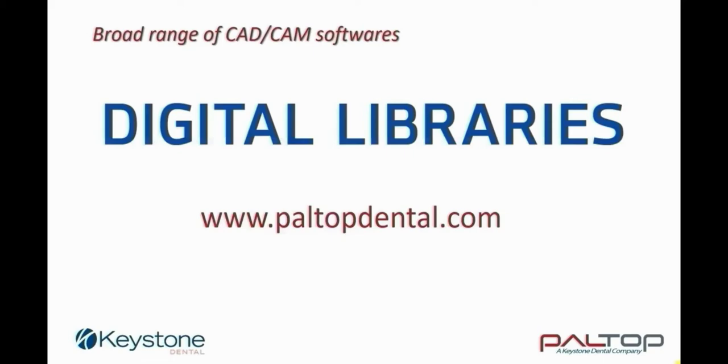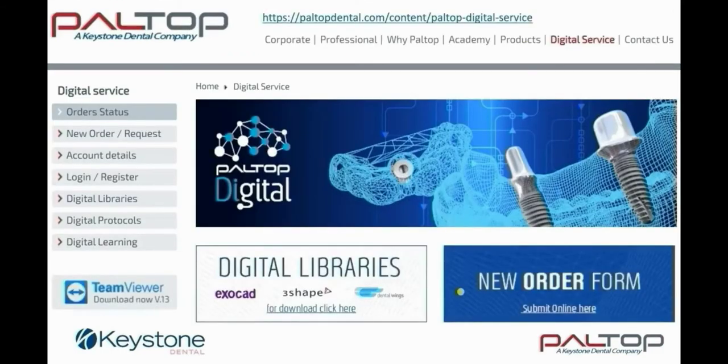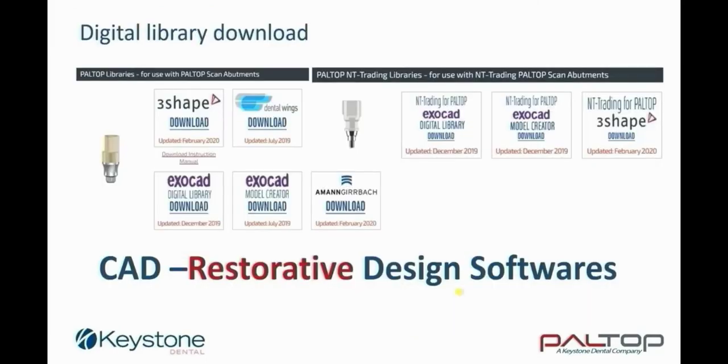You may find our digital libraries on our Paltop homepage. Click on Digital Service and click on the icon for Digital Libraries. This will open all the libraries for Paltop restorative components. Please note that the libraries are updated regularly. Ensure that you have the latest version.